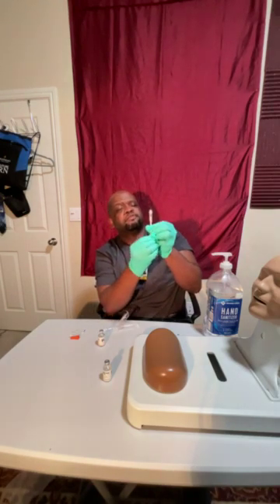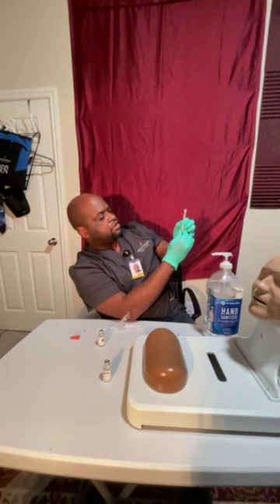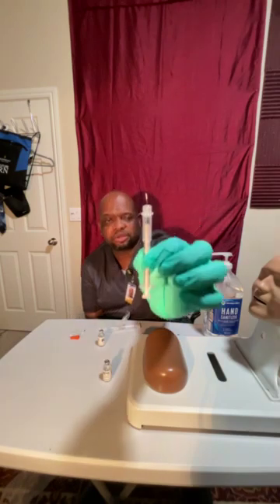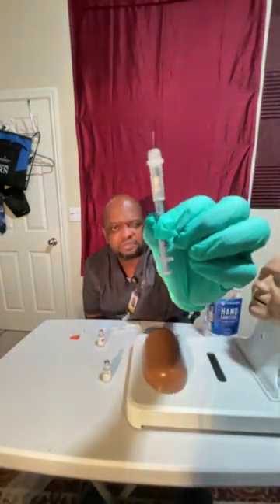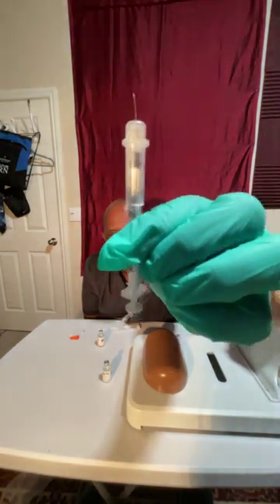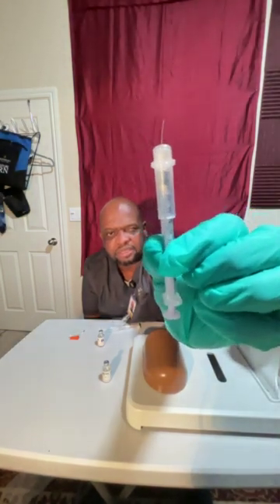Then I'm going to draw up 4 units of air. All right. Let's go with 4 units of air. Let me find that 5 and just go right up under the 4 units. Okay. I have Agnes here to verify that is 4 units of air. Good. Now I'm going to bring that closer to you. If you can see that, 4 units of air. There's a 5 there. Okay, I think you can see that.